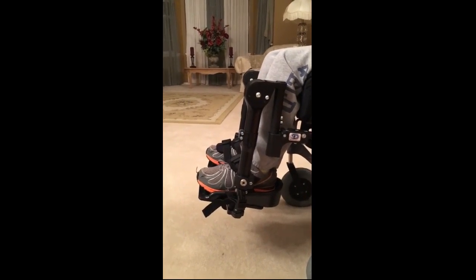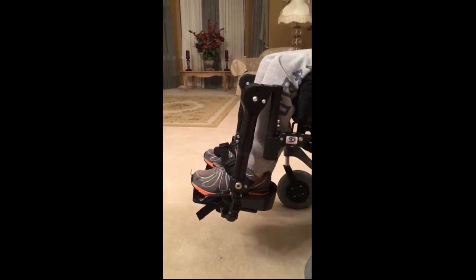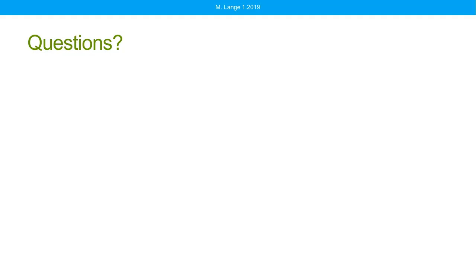Yeah, that time, because before it was more the left. But I think it's cool that he can move them. Some of our older integrated systems that are no longer available in the United States used to utilize a foot board, and sometimes these only responded if a client pushed fairly equally with both sides of their body. But most of my clients have various tone on either side of the body. So you could see here that Spencer sometimes pushes more with one side of his body than the other.